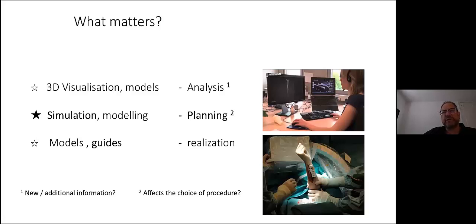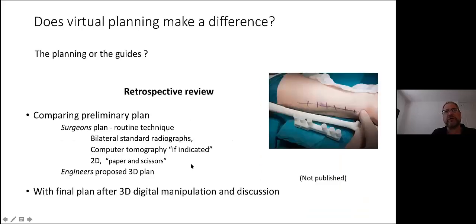So I think it's really interesting when an engineer and a surgeon sit down and really analyze things together and plan. I really like that. So this part I'm interested in, and also, as I said, the guides are really good during surgery. But does it affect the procedure? I was curious about that, so we made a small study here.